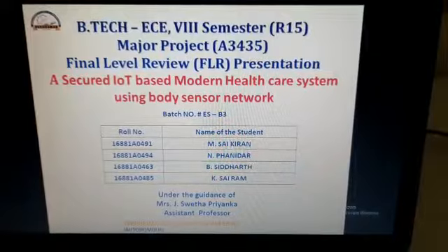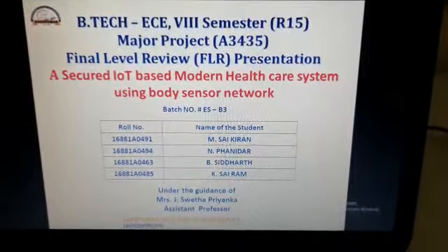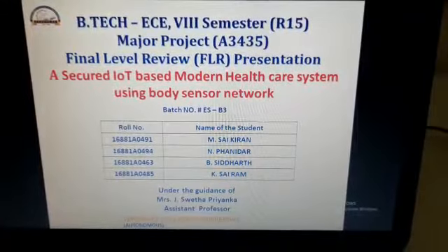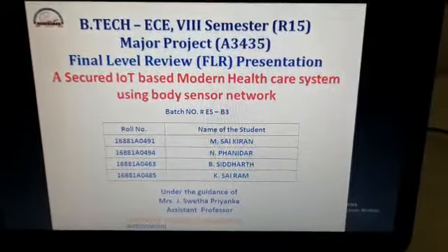The main objective of this project is to measure the sensors' output and display it in the cloud, to monitor the temperature, heartbeat and breath of the patient continuously, to know when a patient falls down suddenly, and to send a message to the doctor or the caretaker whenever an abnormal value is recorded.